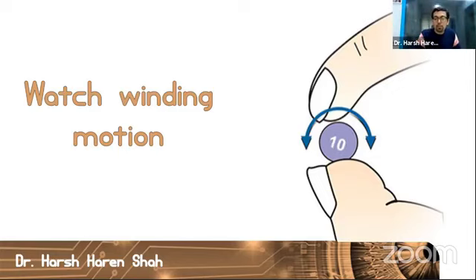So if I were to put it into perspective, just pay attention to this file here. This is exactly what we'll be doing. We'll be vibrating it slightly clockwise, slightly anti-clockwise. Remember, watch winding motion will eventually not bring about any rotation of the file. You will still be left at the same point from where you started. So the chances of separation or other iatrogenic errors are greatly reduced here.